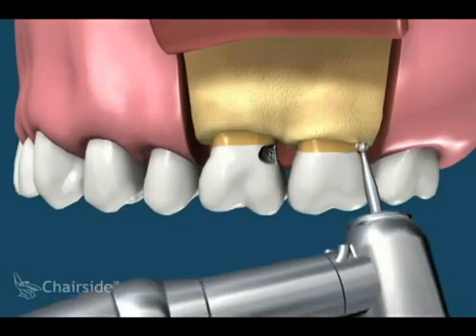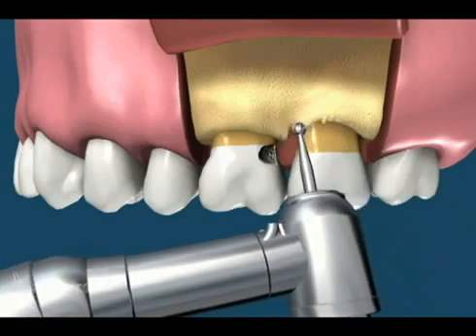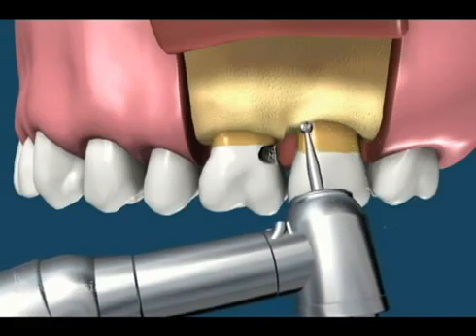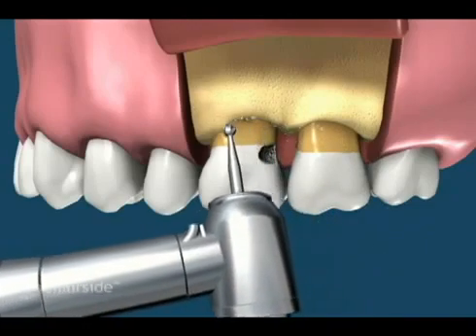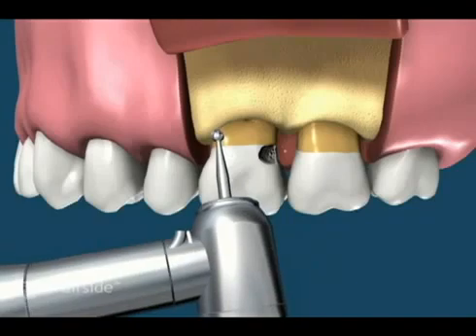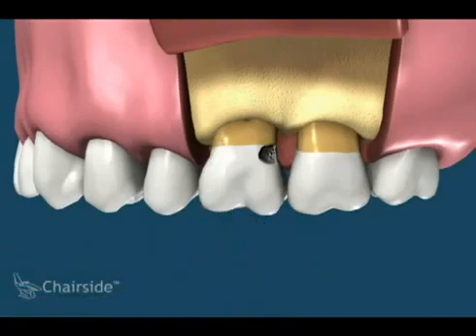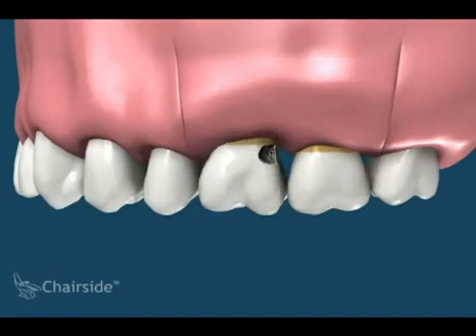Different instruments, including the dentist's drill, are used to reduce the bone height, and this new bone architecture is prepared to support the gums in a lower position on the root of the tooth. The new bone topography must follow all the previous peaks and valleys. The gums are then repositioned on the prepared bone, which now supports the gums below the cavity.